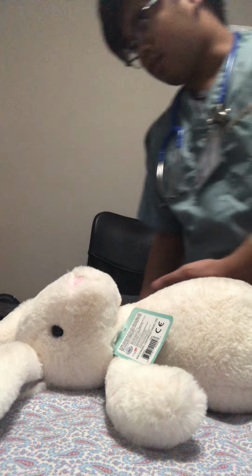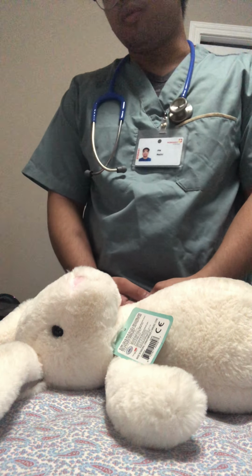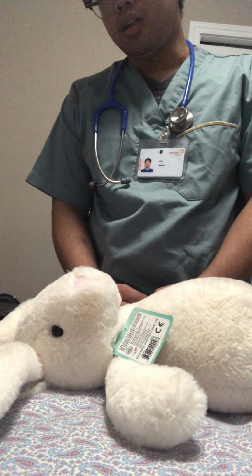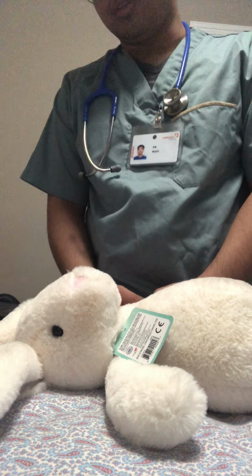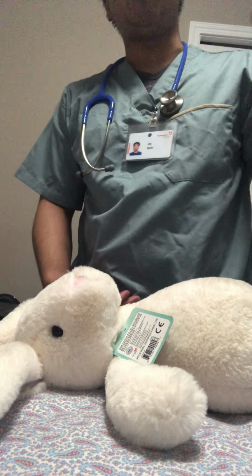Now, applying hand hygiene. Hi, my name is Neil. I'll be your nurse for today, and I'm the one who's going to administer your heparin medication through subcutaneous injection. So first off, I'm going to provide privacy for the patient.